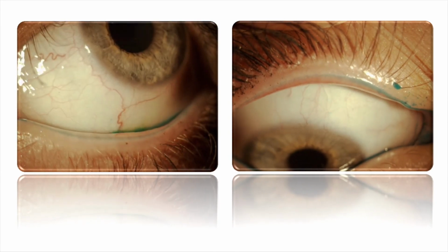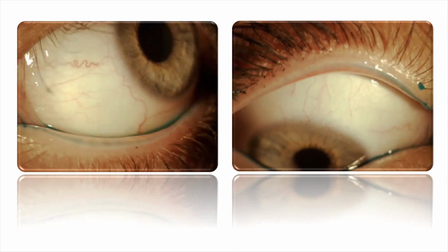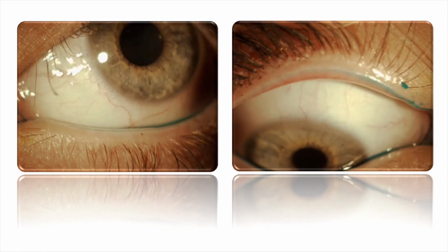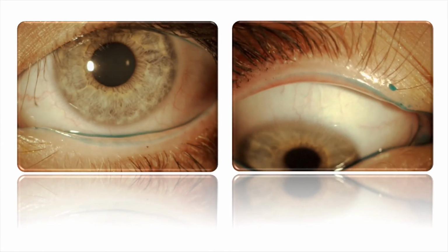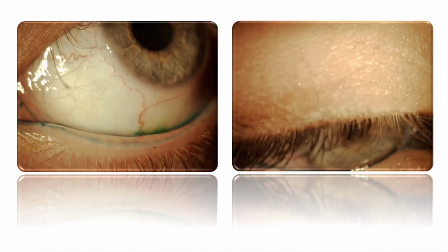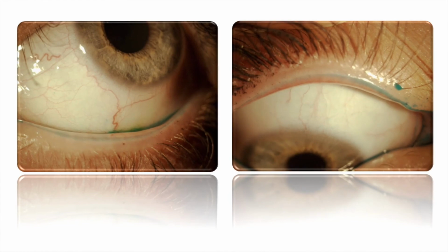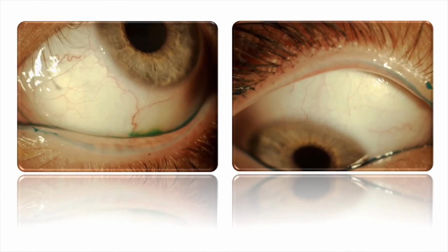We grade this area of staining as mild if it's just a faint line, moderate, which is a wider line but does not cover any of the meibomian glands, and severe when the Lissamine green has stained over a portion or even all of the meibomian glands.